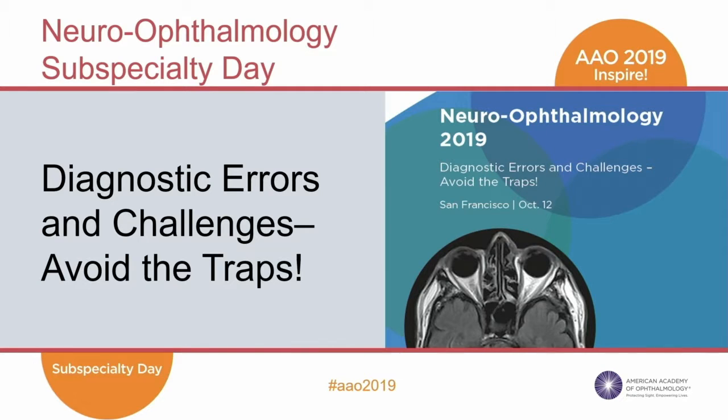It's not like I'm going to take that information and say to the patient, I think you're going to do well after a surgery. You don't want to do that for a number of reasons. First, we haven't commented on this, but the technical quality of the OCT scan has to be scrutinized. There are a number of reasons that cause the quality of the scan to be poor.